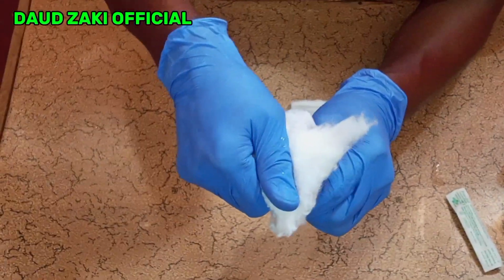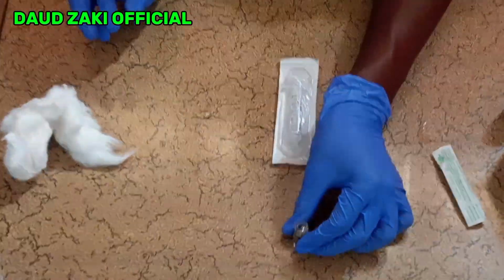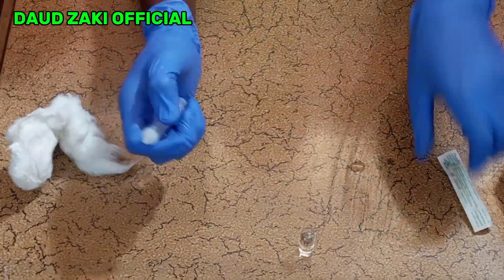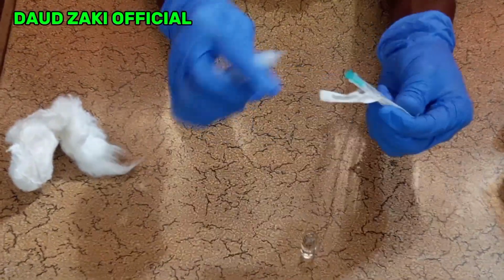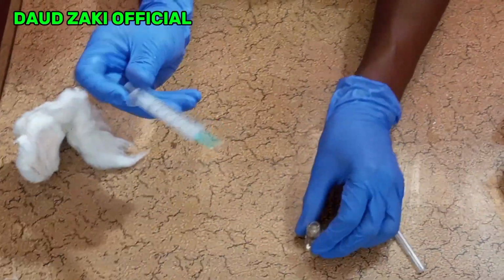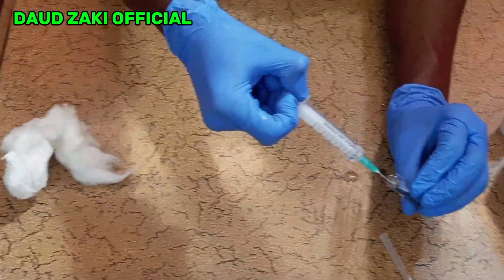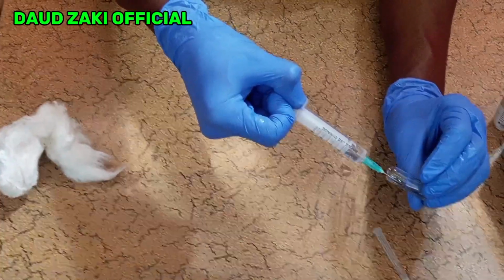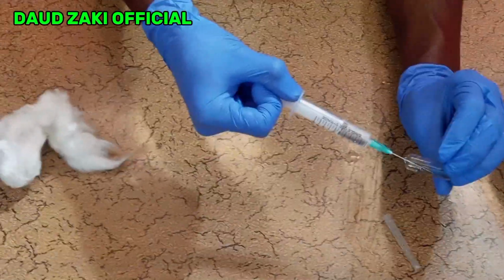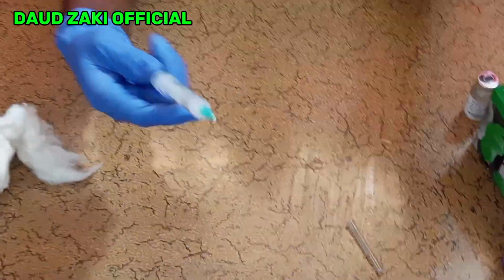This is how you are going to break the ampoule. Then when you break it, you get the syringe and withdraw the drug from the ampoule. You insert the needle into the ampoule horizontally, upside down. You pull back the plunger to withdraw all the medication. Ensure that the tip of the needle is within the liquid to avoid air bubbles rushing into the syringe.